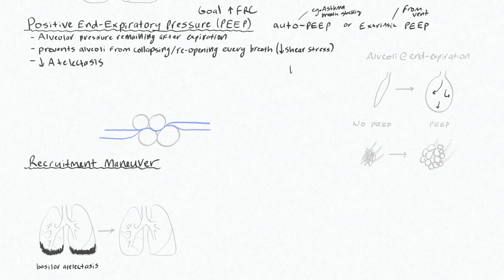Let me draw out this pulmonary compliance curve to show how we can optimize our lung compliance by utilizing PEEP. On the x-axis, we'll have pressure, y-axis, volume.